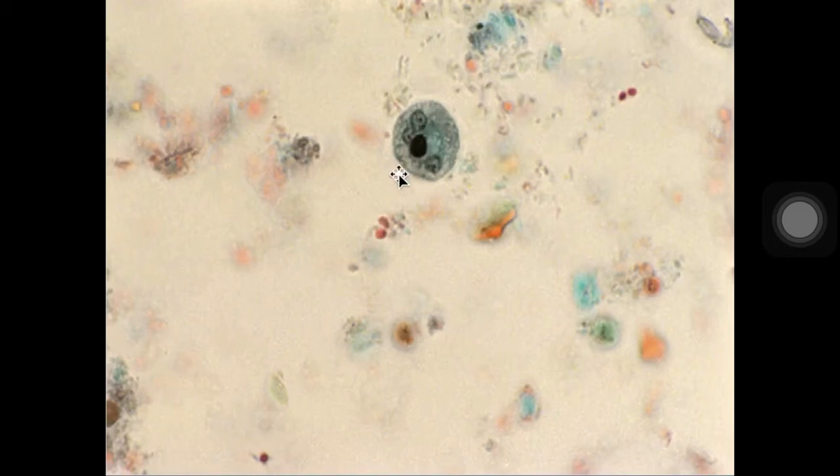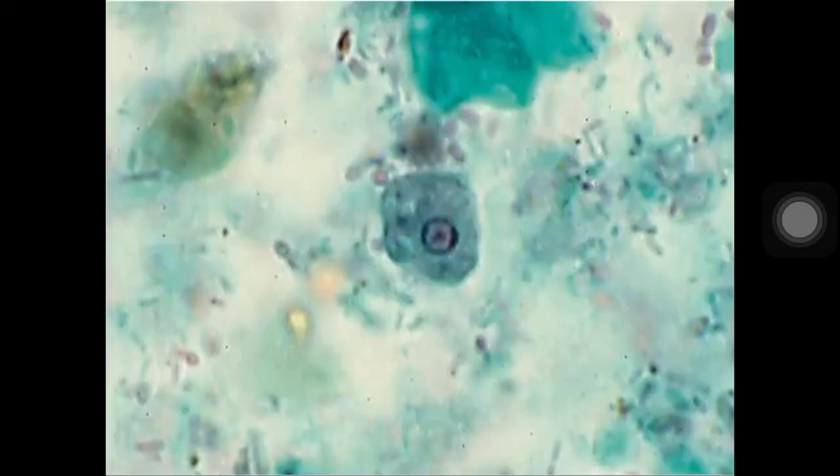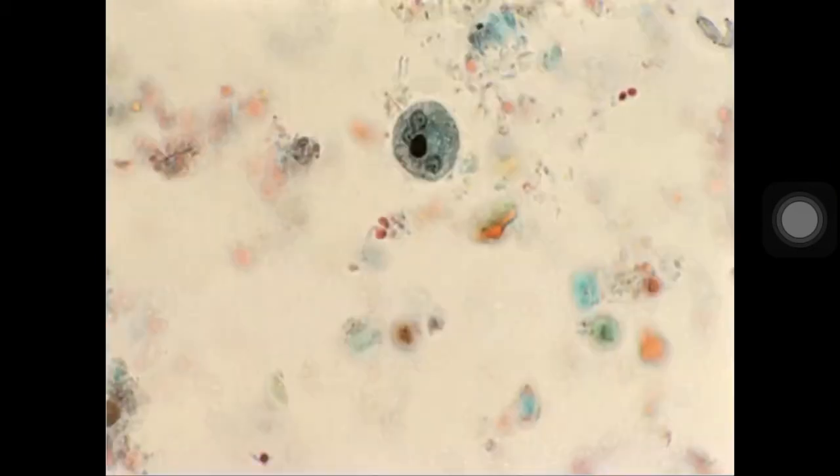Again, ang trophozoite po laging isang nucleus lang pwede maging present doon, no? Such as in this case, no, this one is Entamoeba hartmanni trophozoite po ito. But this one is Entamoeba hartmanni cyst. Okay? So meron siyang 3 nuclei na present dito, saka meron po presence ng chromatoidal bar, which is only present in the cyst form. Okay? So again, the cyst form is the infective stage, tama, as we know, while the trophozoite form is the feeding stage, no, to obtain nutrients. Okay? But the more resistant stage nga is the cyst, no? Hence it is the infective stage, no? Especially for your Entamoeba histolytica being the truly pathogenic amoeba.